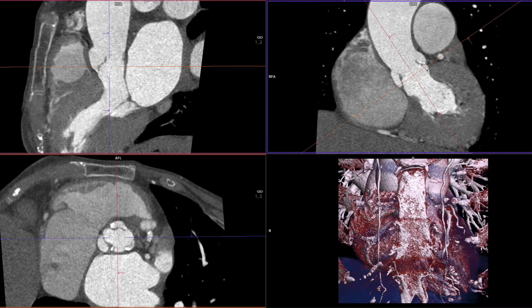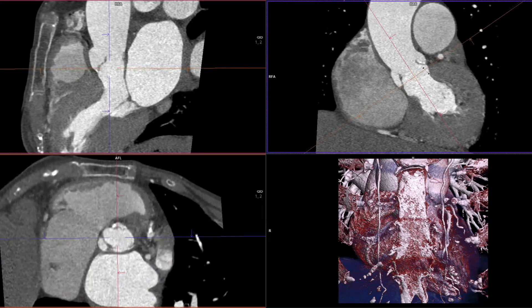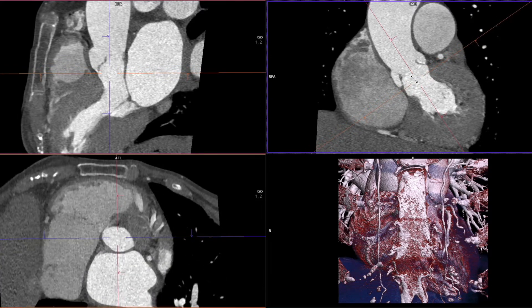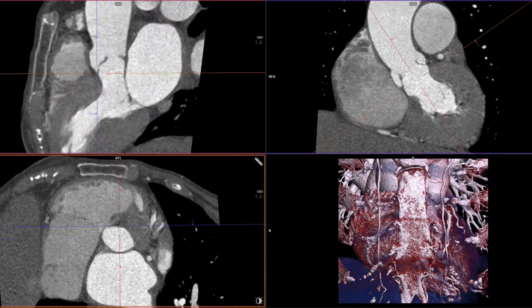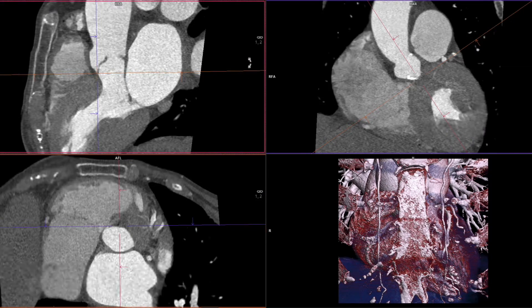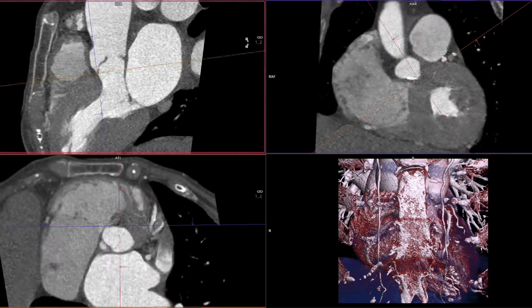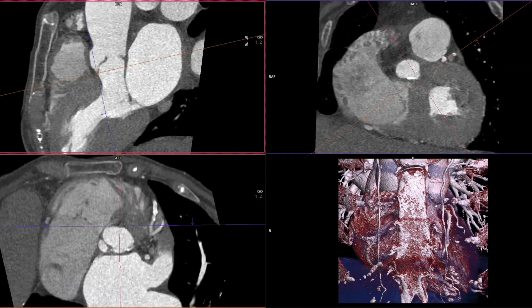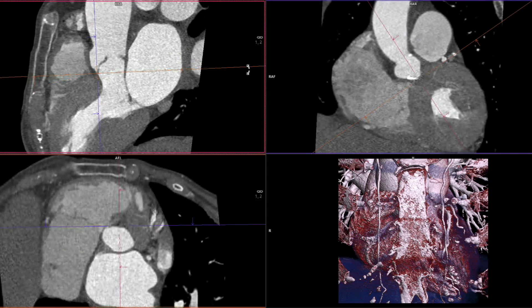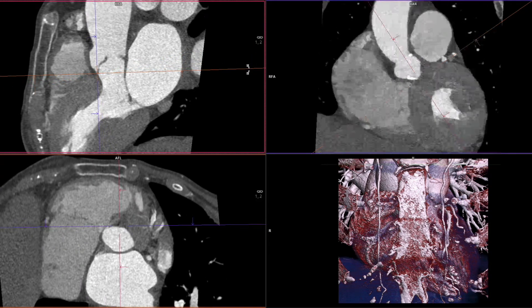We start by creating the aortic annulus plane in a standardized fashion. We align all three aortic valve cusps' lowest points in the lower left-hand image by moving the orange reference line in the upper right and left-hand images.